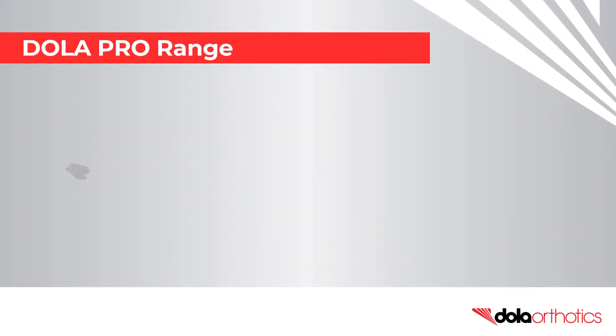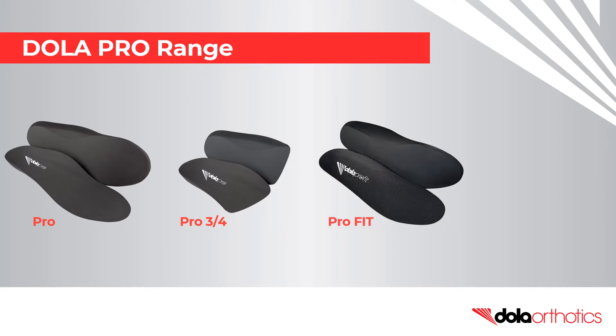Fit customizations can be performed on the entire Dollar Pro range. If you don't have a grinder, the Pro Fit and Pro Lite are popular low profile options.